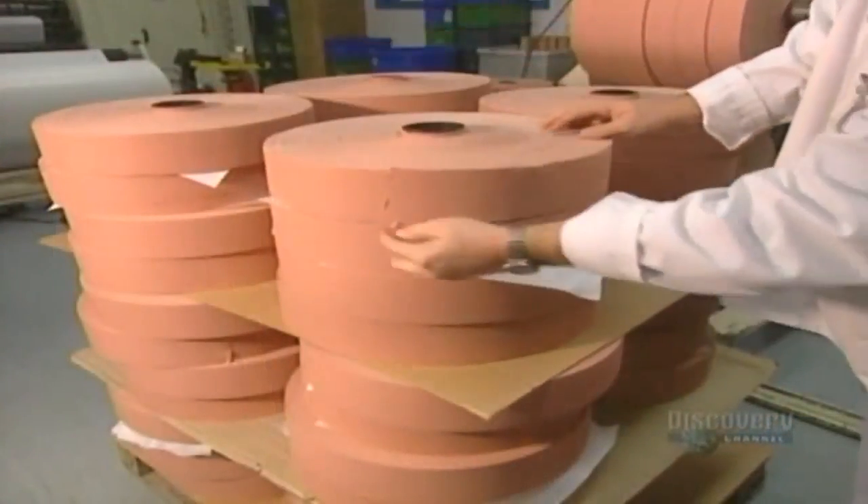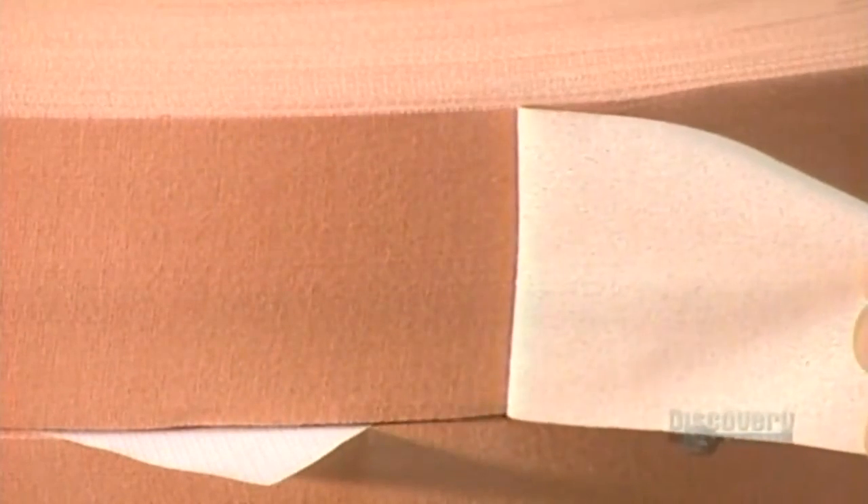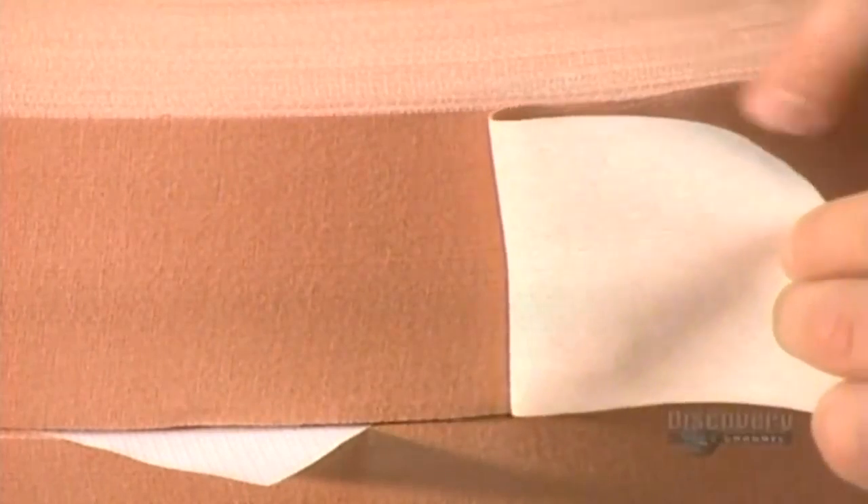Once the rolls have been properly shaped and trimmed, they are ready to be processed further, and the next step is the application of the little cushioned protective pads at the center of the adhesive plasters.